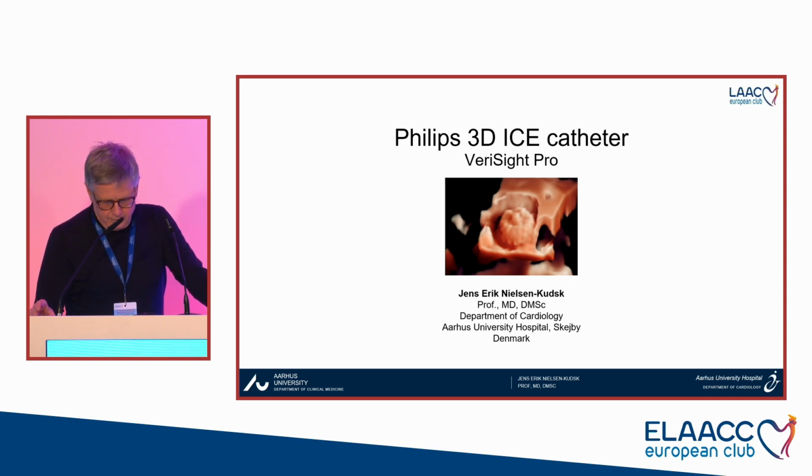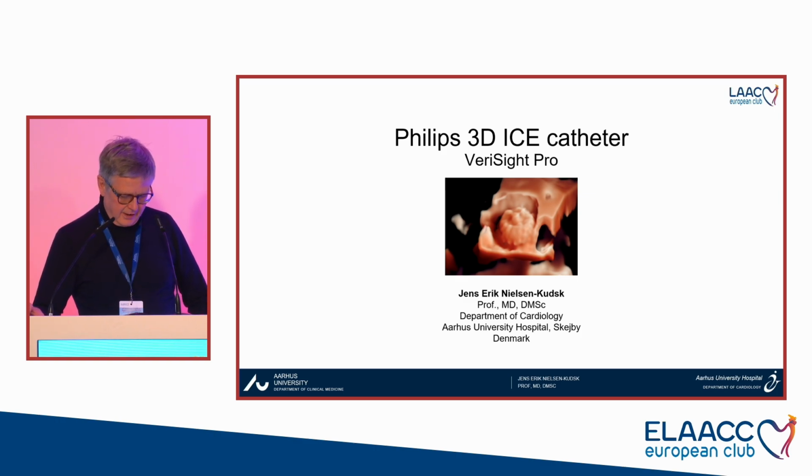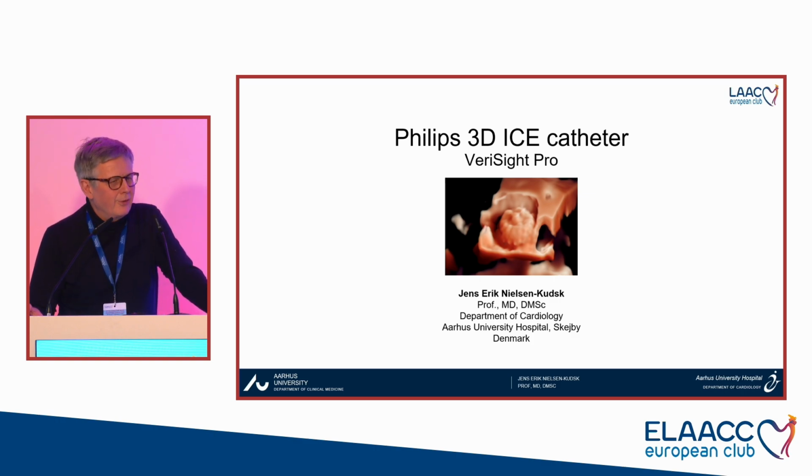I had a visit from Philips, a group of Philips engineers that had the task of creating a 3D ICE probe, and they studied our workflow, and they studied the image quality that we have with the ViewFlex and with the AccuNav catheter, and I also had an opportunity to give my input to the design of this Philips 3D ICE catheter. And I have been struggling ever since to get it into my lab, and I didn't succeed, but only within the next few months I will have this catheter.